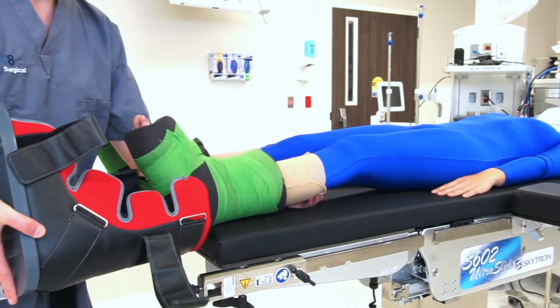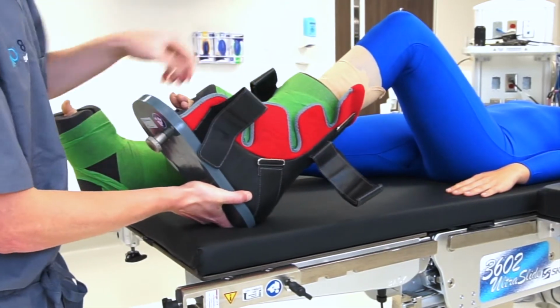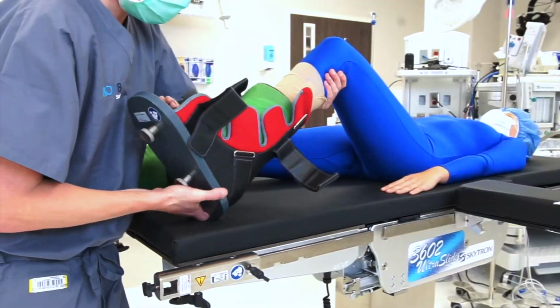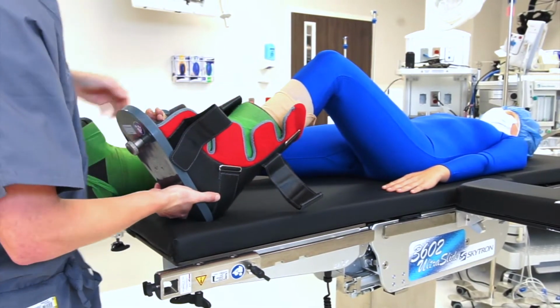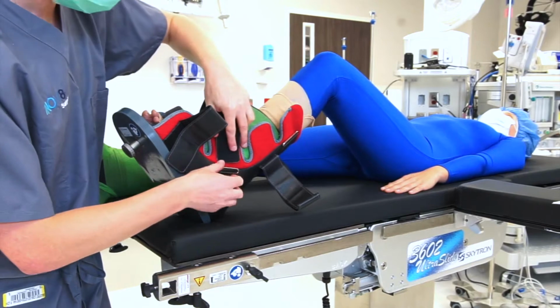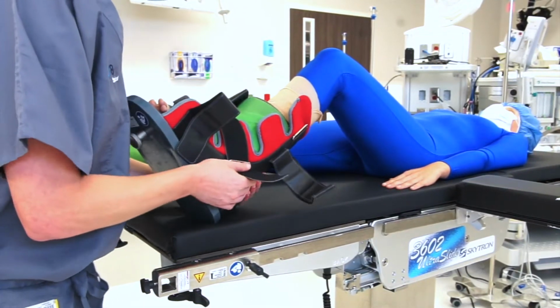Slide the foot into the traction boot. Ensure the traction boot flaps are free and not folded under the foot. Flex the knee and push on the bottom of the boot to ensure the heel is fully seated. First, secure the strap over the ankle. This strap is the most important for holding the foot in place.